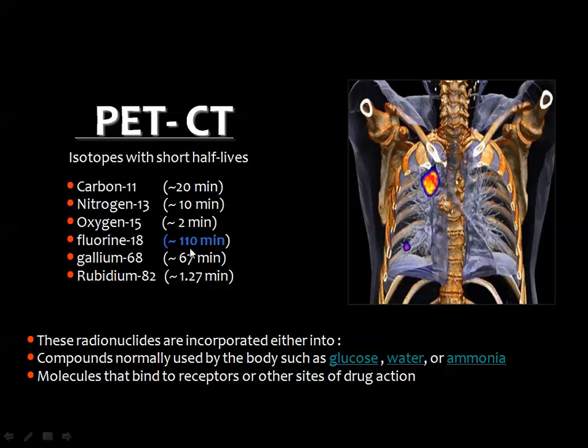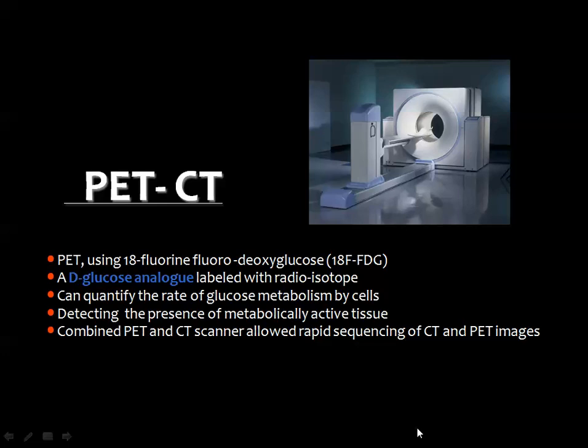Then this isotope is injected intravenously, and then the patient is scanned, and you look for the metabolic activity of the region to be examined.